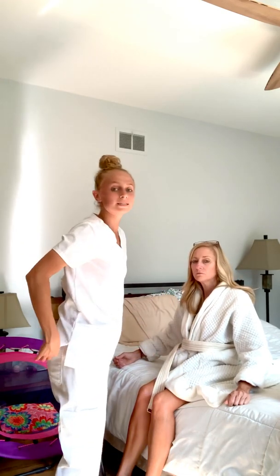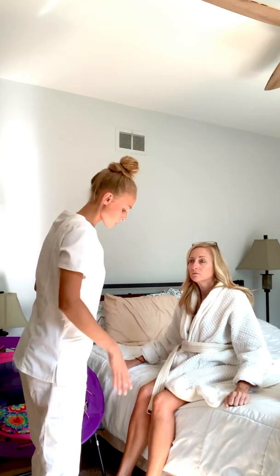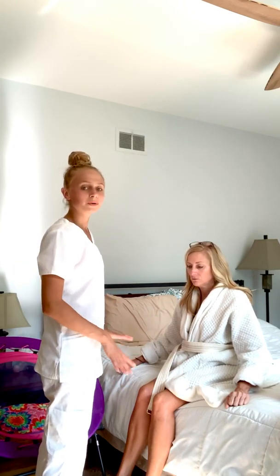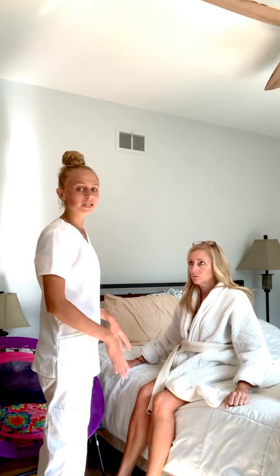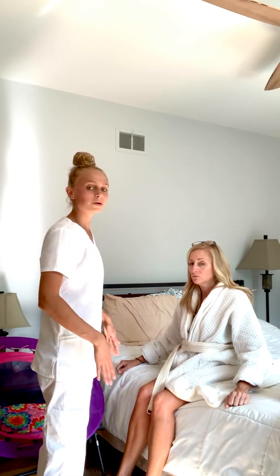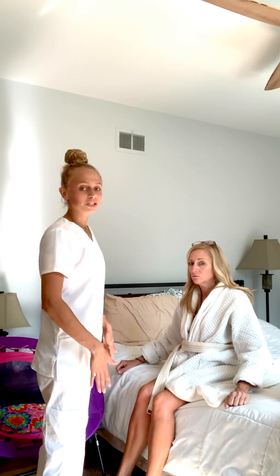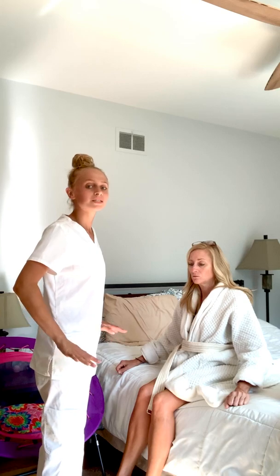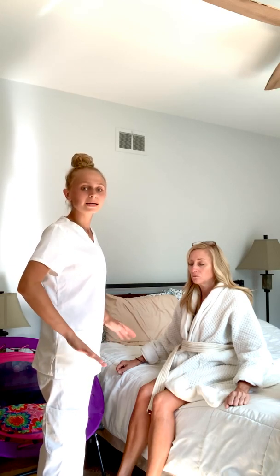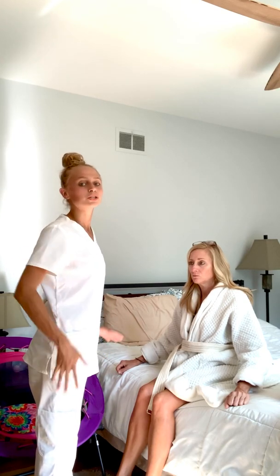So after this, my patient's feet are going to be flat on the floor, and then our feet are going to be touching each other's, as well as our knees are going to be touching each other as well. And then my patient's hands are going to be on the mattress, and I'm going to explain that on the count of 3 is when she's going to push up.